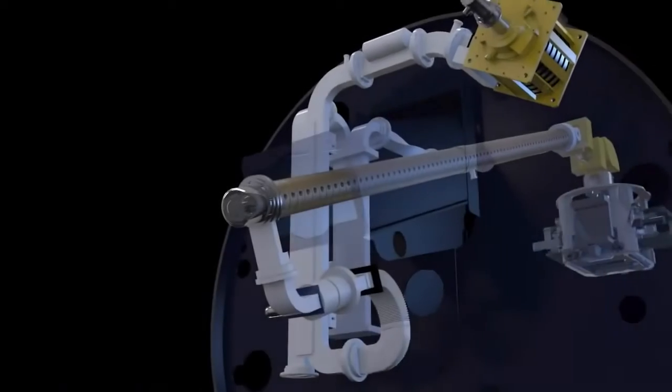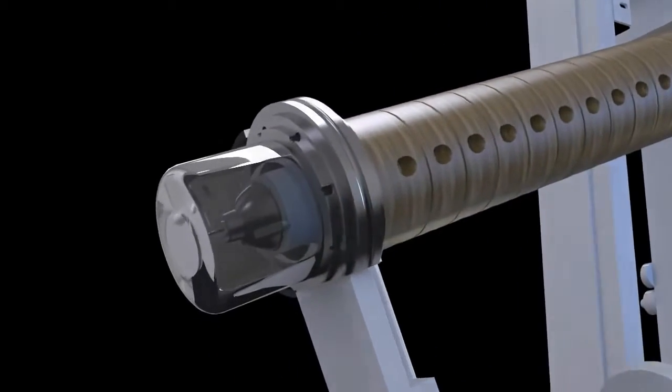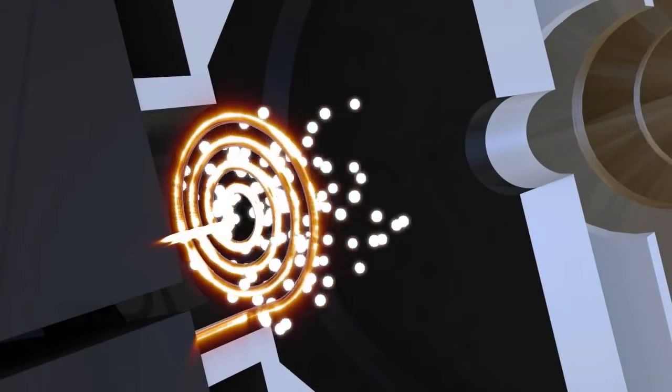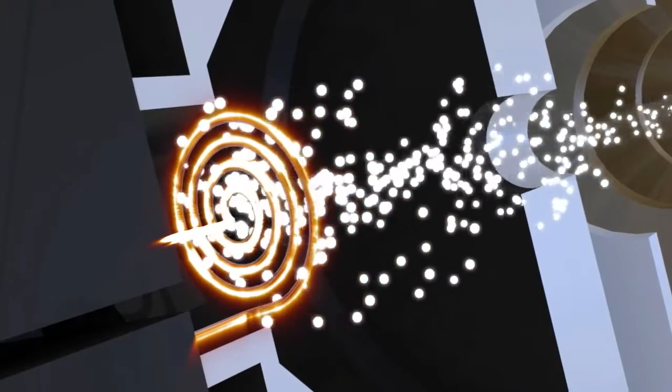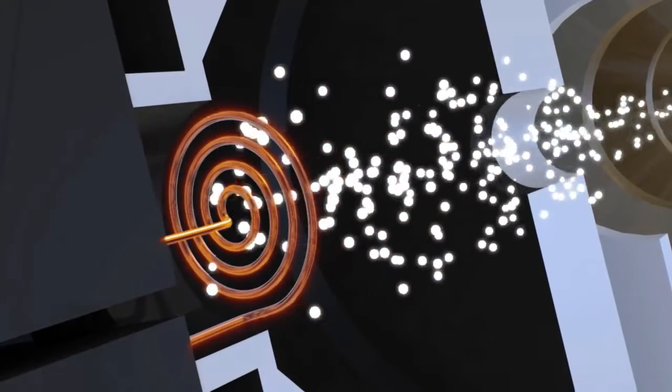The digital accelerator uses a diode-type electron gun situated at the end of the waveguide. The electrons are produced by heating the tungsten filament within the cathode and are then injected into the waveguide. The number of electrons injected is controlled by the temperature of the filament.